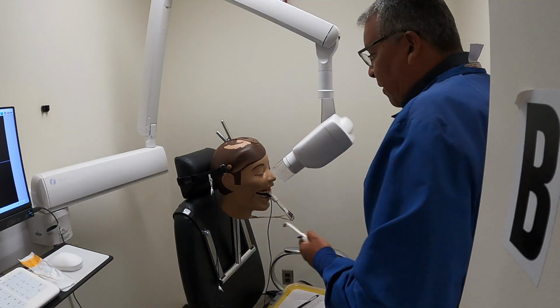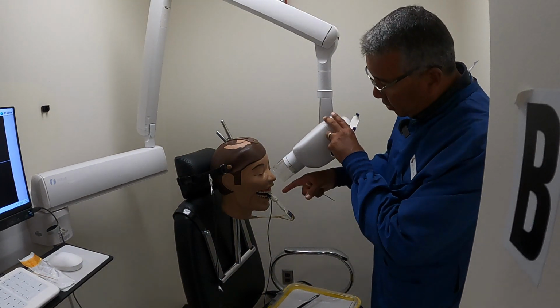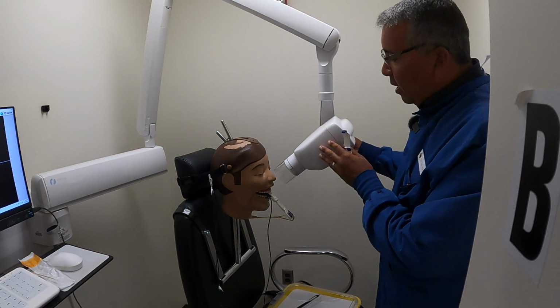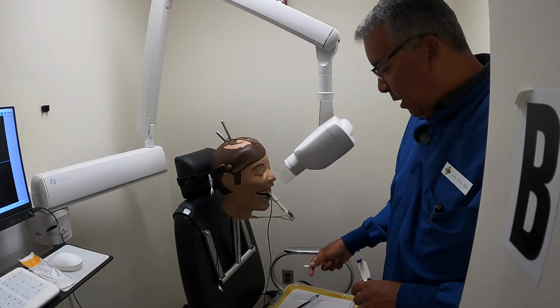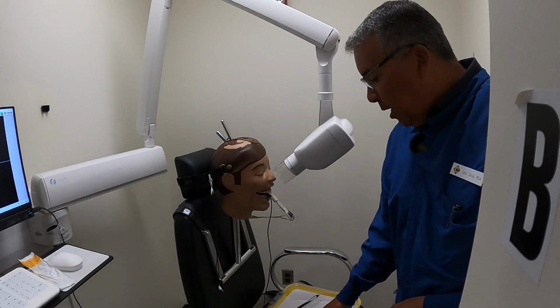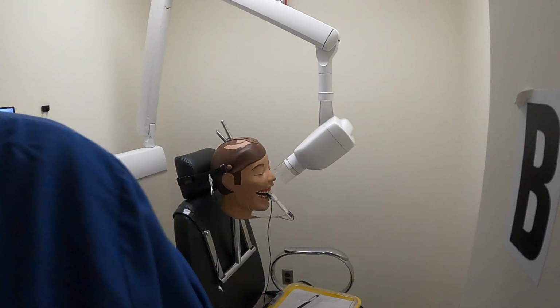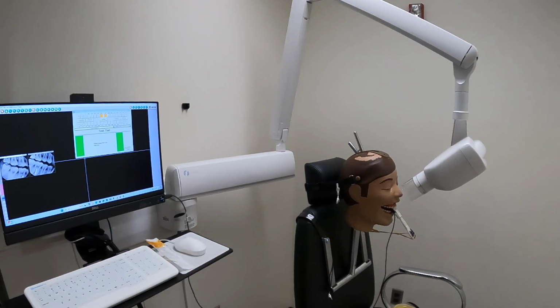So I've got my vertical, I've got my horizontal. I'm just going to take that and bring it down a little bit further, and it's right there at the rim. Okay. And then I'm going to take this x-ray just so you can see this. I didn't change the vertical. This vertical was the same as this one, right? Y'all agree? I'm going to take the x-ray just as it is. And then maybe I can put both in the same. So I'm going to turn that just that way.